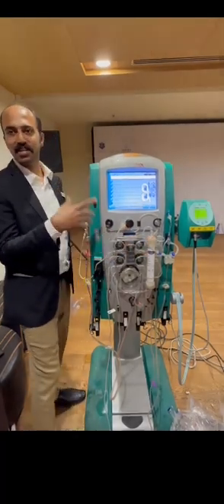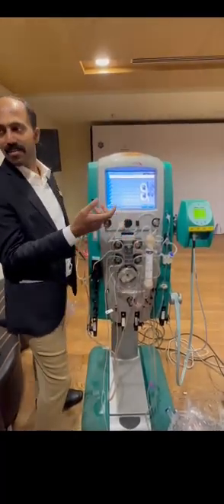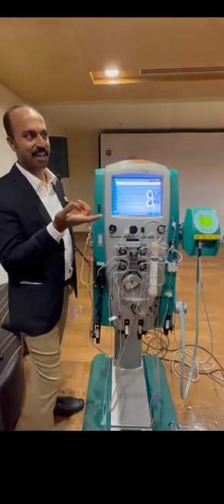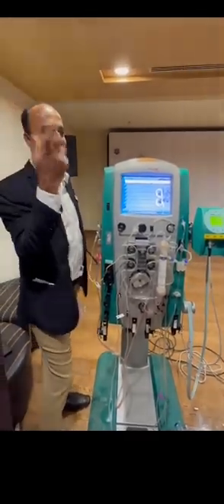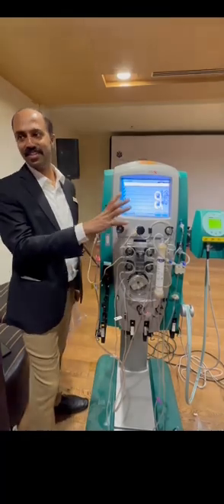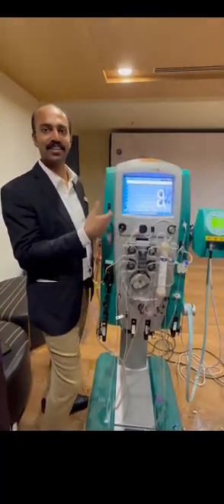That depends on the anticoagulation we use and the patient. Usual target is 48 hours, 72 hours. If anticoagulation is there, easily we can run. I have used it around 6-7 days continuously. In Delhi, somewhere they are using even 9 days with citrate anticoagulation. But still, it depends on the patient. The major factor is the blood flow. If blood flow is good and access is good, we can run it easily.